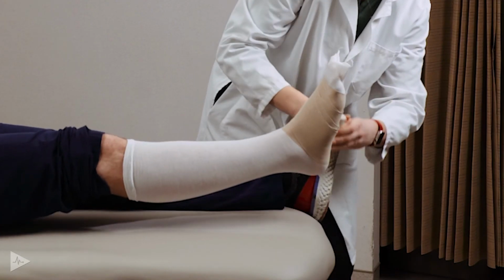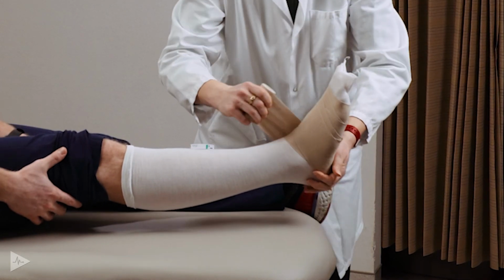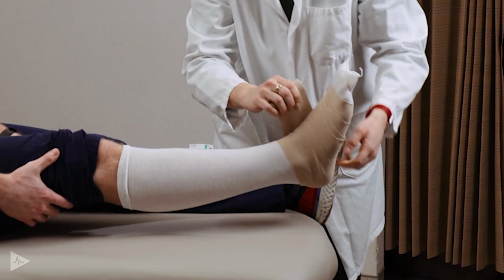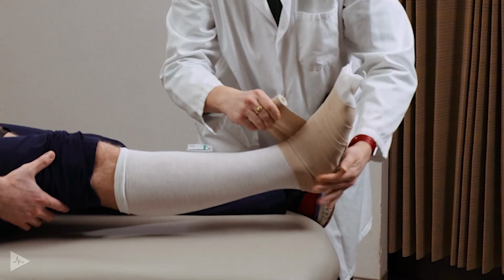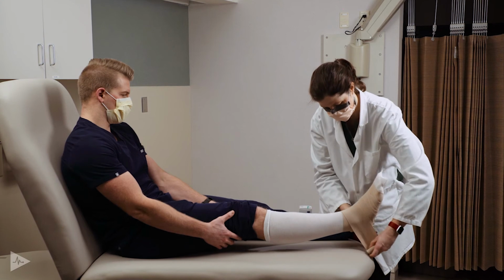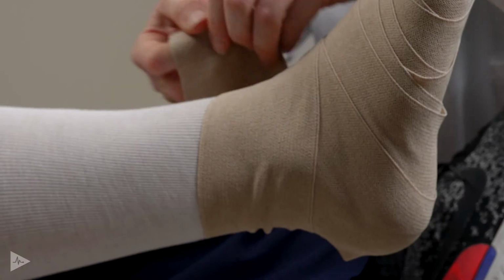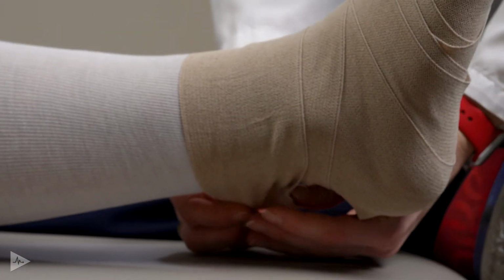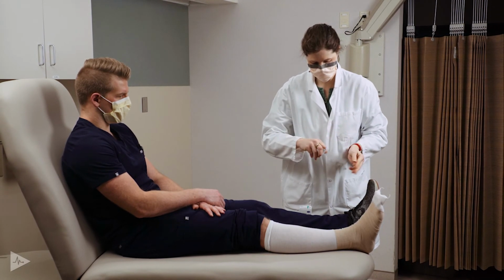We want to make sure when we wrap the ankle, aim for about half the ankle in one wrap, and come around and get the second half in the next wrap. Continue that crisscrossing pattern. With the low stretch wraps, you don't have a lot of tug. You want to try to apply a little bit more as you're going through the lower part of the foot and ankle, and then coming up, and that initial wrap will stop just above the ankle. We like to secure that in place with the use of tape.